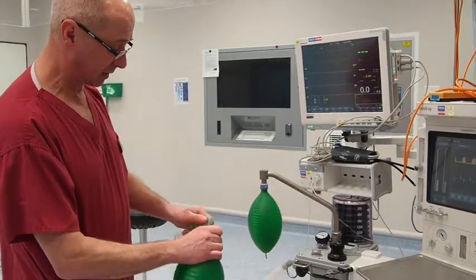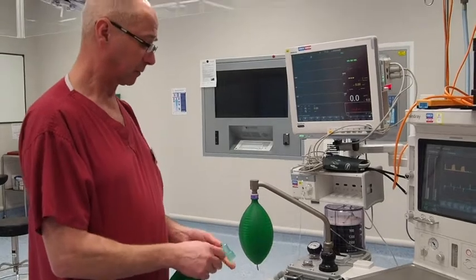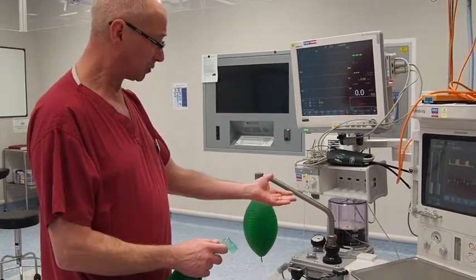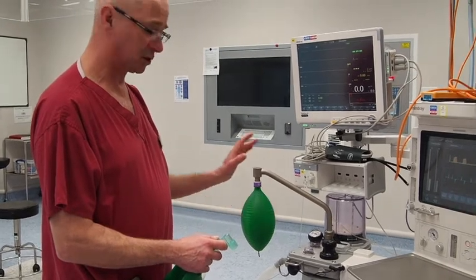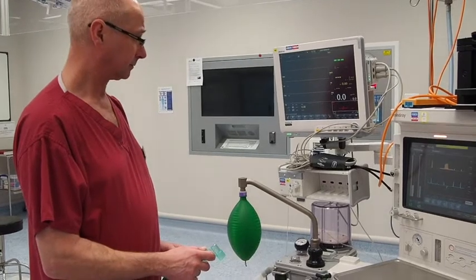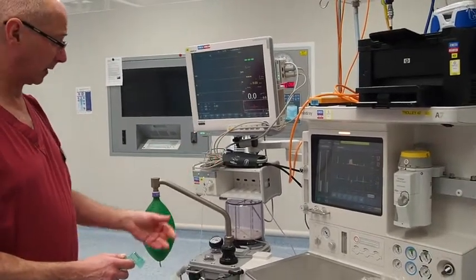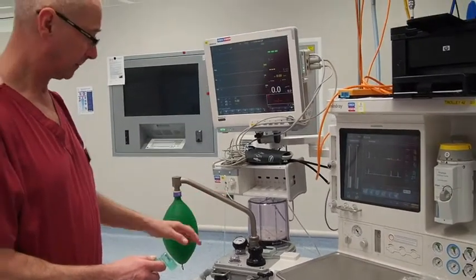So if I was to do a patient disconnection, and this would happen with patient suction as well, we do inline suction, the bellows will collapse. And when the bellows collapse, then the patient will not ventilate after the bellows are empty. And the machine will start alarming. And when you get the machine alarming, always check that there's gas in the bellows.